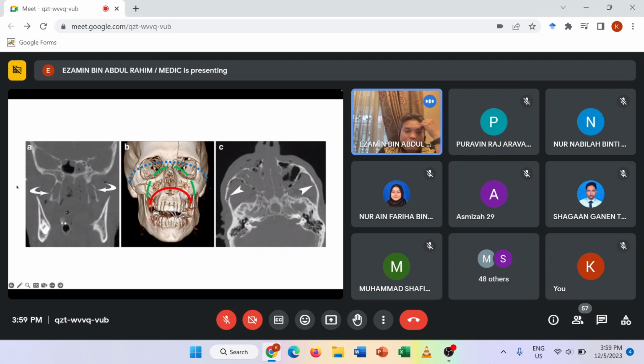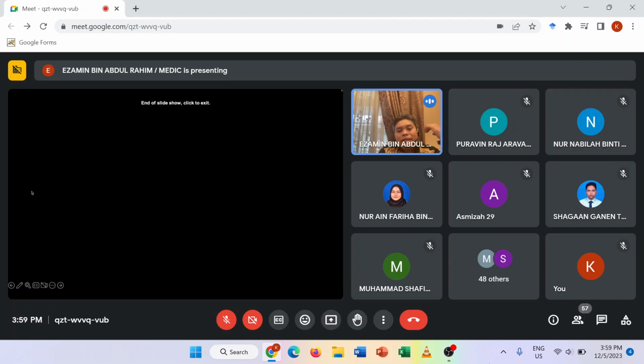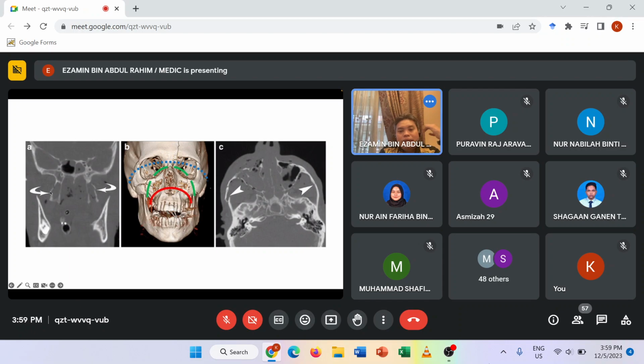Okay. This is the best for fracture, for bleed, CT scan. You remember this? You don't remember in my lecture, for fracture and bleed, CT scan is the best to see. Alright. And also for calcification, CT scan is the best to see.